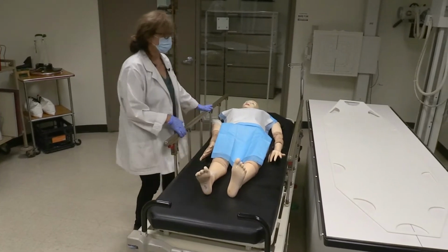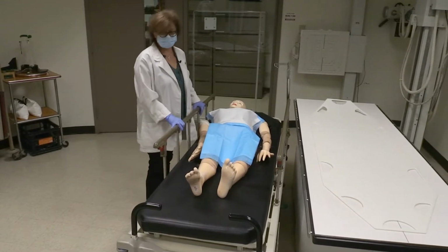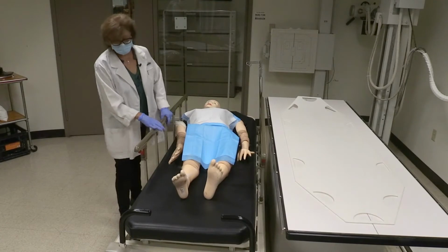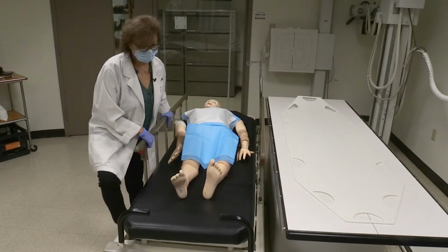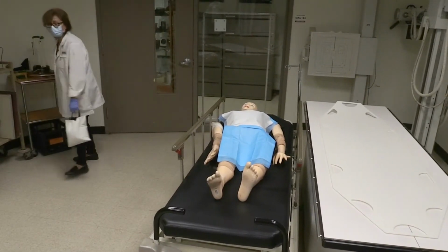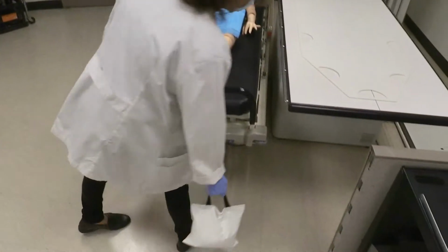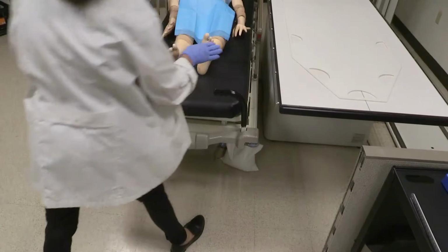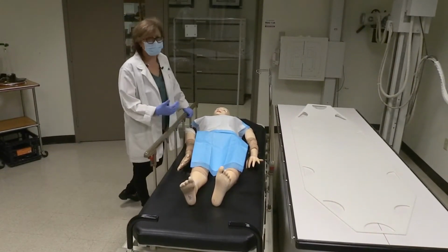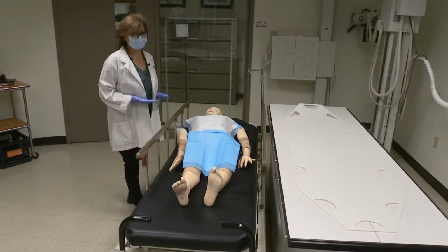So if I want to move this patient onto the table and this patient is not able to stand and needs assistance, I'm going to put the stretcher close to the table, put my brakes on. If I have sandbags available, I will use them as well, just for additional safety. Although I have checked the brakes work, I want to make sure that I have additional support at the wheels. The next thing I'm going to do is raise this table up to a comfortable position for my height.